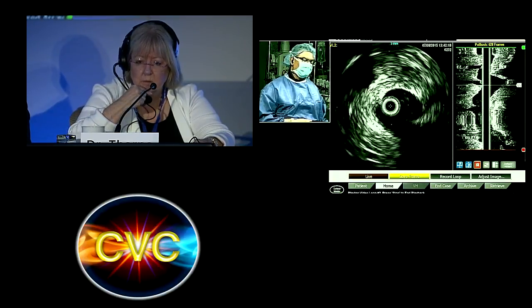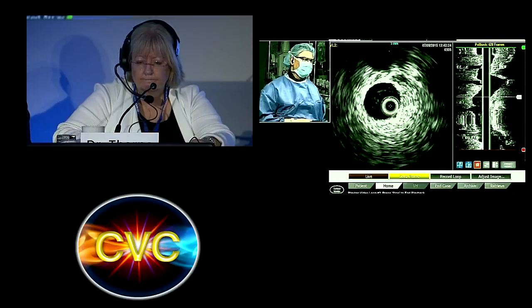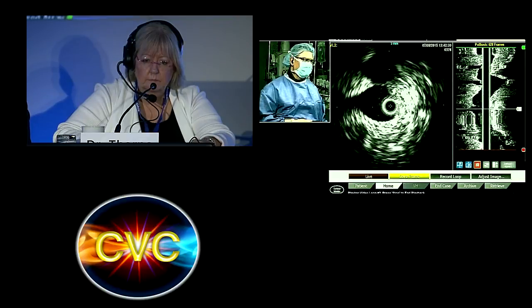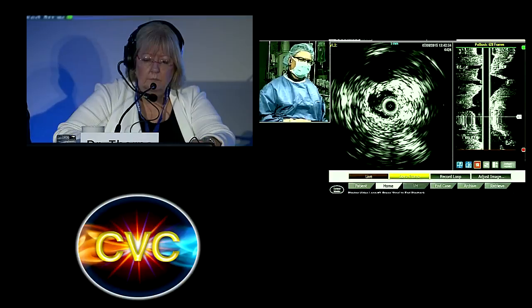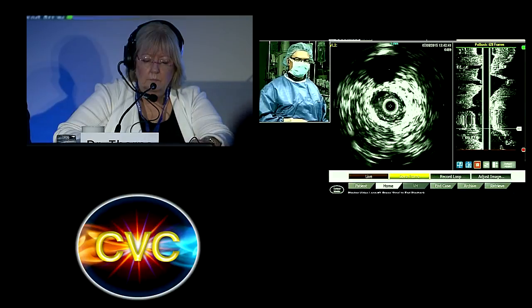Maybe? The puncture, well, this is the left side. I doubt that they chose the left side to put the filter, knowing that the patient has a left DVT. I would rather believe that they used the right groin for that. But definitely that's the area where the clot was sitting. Perhaps, we don't know. We don't have any studies from 8 months ago to see how extensive the DVT was.